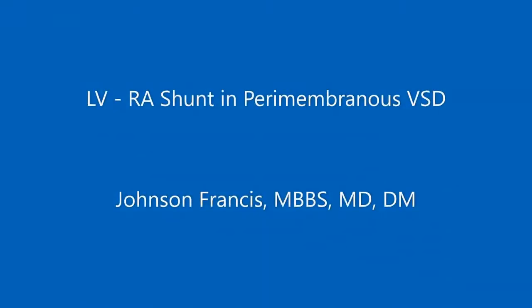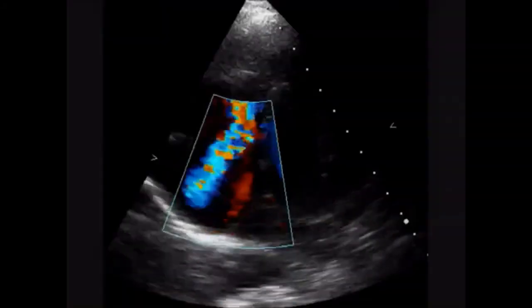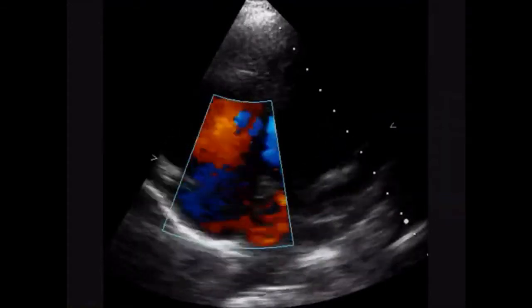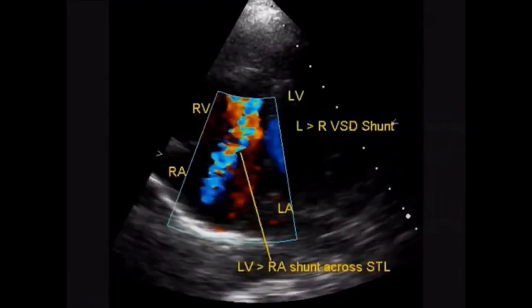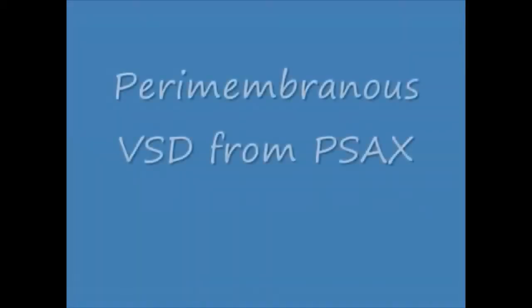Here is an echocardiogram of an LV-RA shunt in perimembranous VSD, now seen in the apical four-chamber view. The jet is passing from the LV to the RA through the septal tricuspid leaflet, for which there is a fenestration. This is the short axis view of the perimembranous VSD.